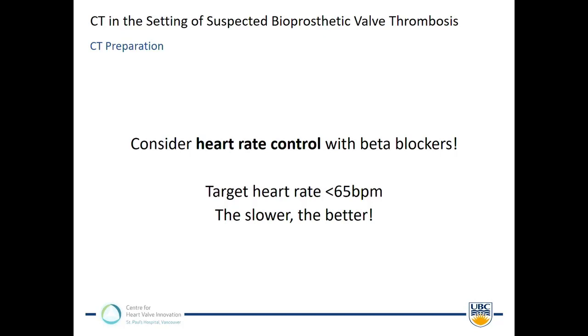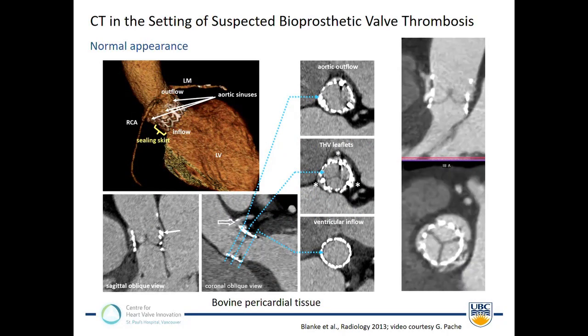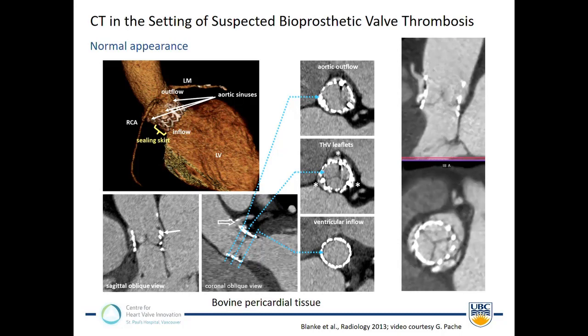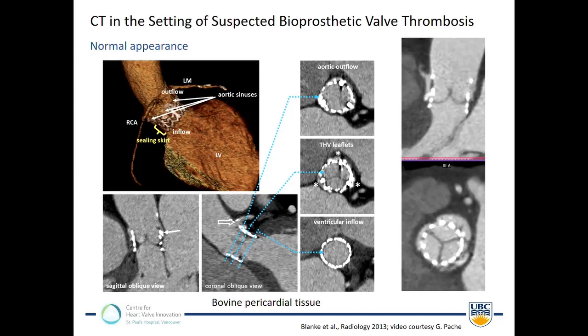However, those patients that have been treated, they don't have aortic stenosis anymore, and for that reason, you should really think about lowering the heart rate prior to performing a post-TAVR CT. And I think the slower, the better, and that's really important for image quality. You should be familiar with the typical appearance. This here is an image which we actually created in 2011 and shows a first-generation Sapien valve, which at that time typically had those very pronounced posts where the leaflets were actually attached to, which then, of course, obviously cast artifacts.